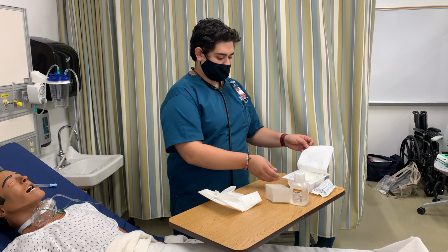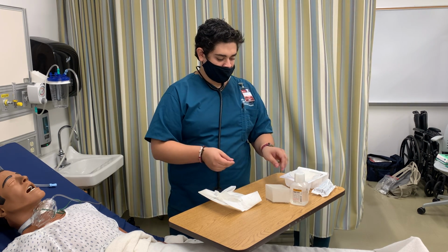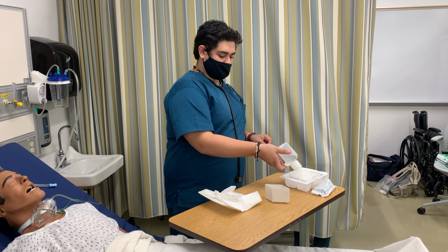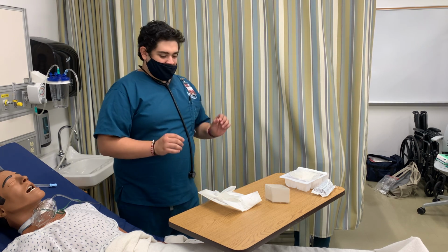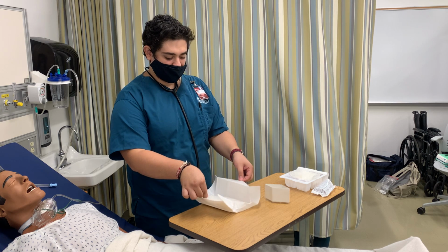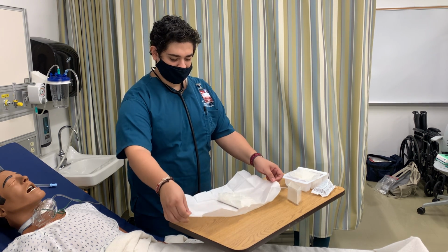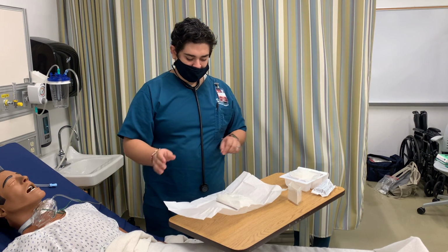I will also be opening my care kit set. Putting my saline, making sure that I'm not breaking sterile field. But having all my equipment ready and open.